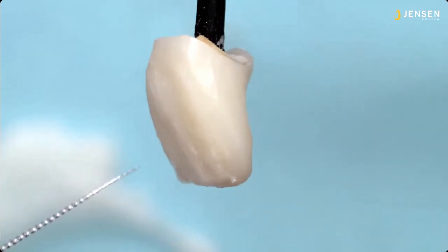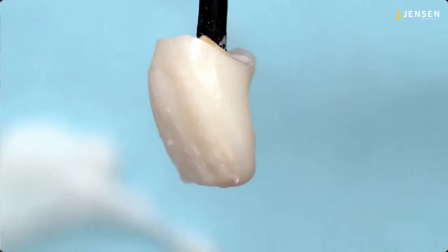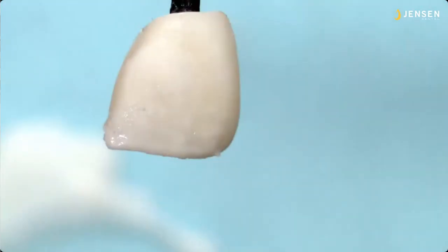Okay, there's an endo file. I'm hitting the base right there. So this is the thickness of a business card. And that's about what we really want. I mean, you can add more if you have to for a line angle or for a CEJ or something.